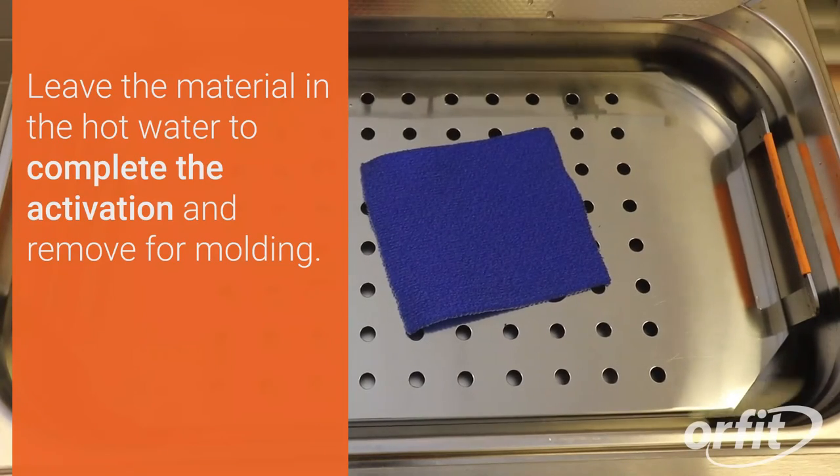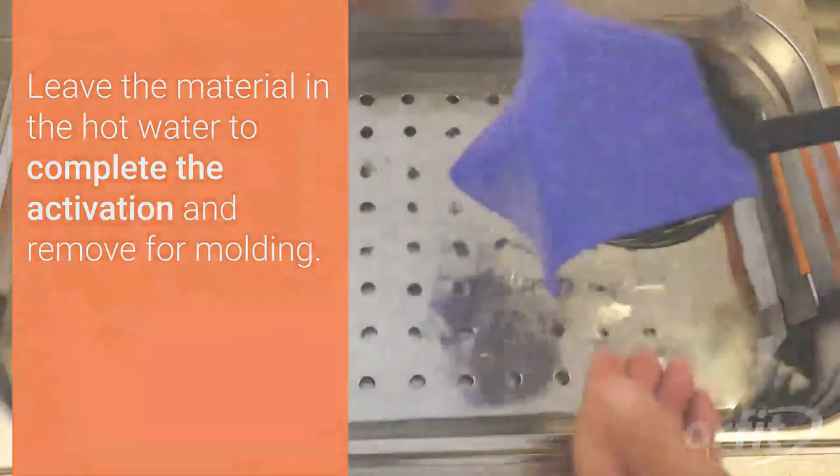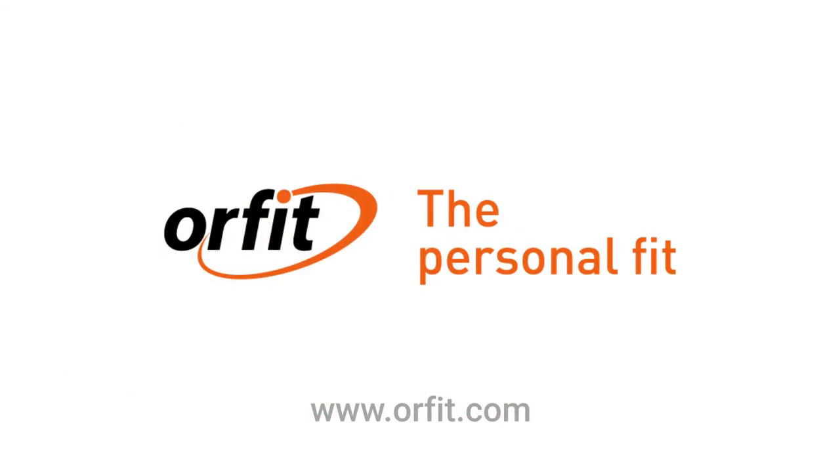Leave the material in the hot water to complete the activation and remove for molding. There it is. The material is ready.